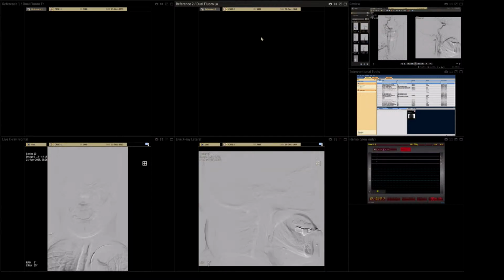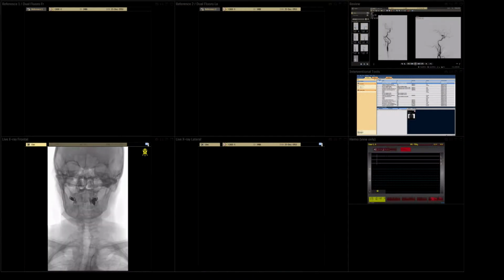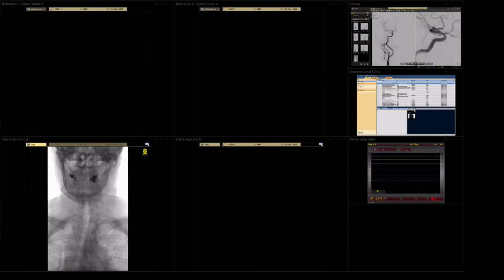71 years old gentleman with the right vertebral artery V4 segment critical stenosis, nearly subocclusion basilar artery stenosis, and right carotid artery supraclinoid segment critical stenosis.